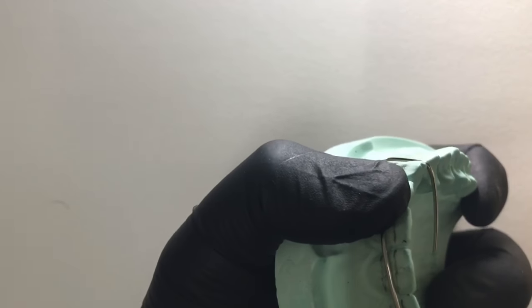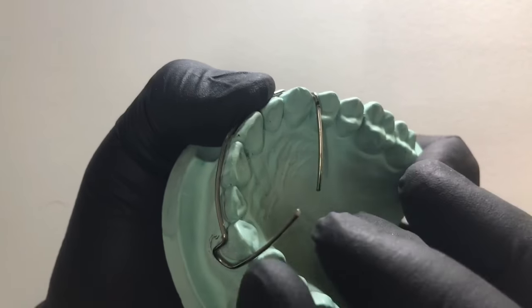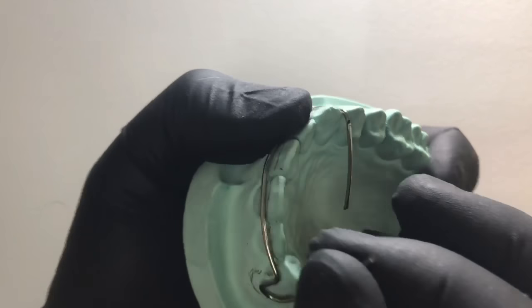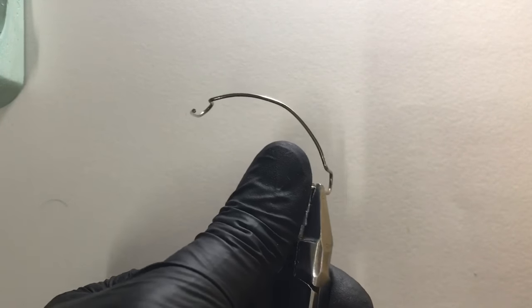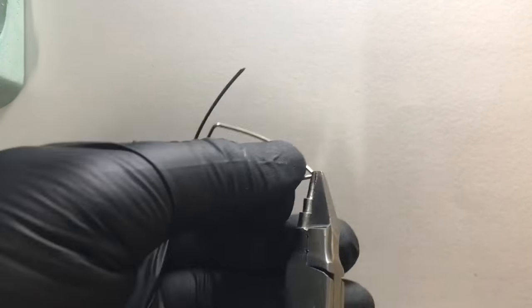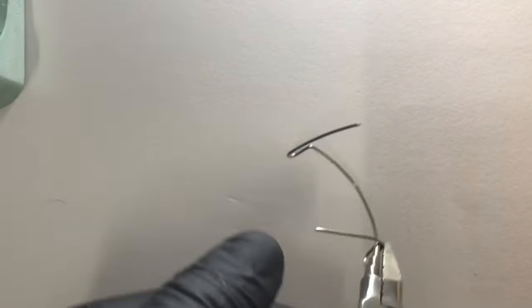Now we need to go completely into the palatal aspect. For that we need to give a slight marking at the free end. Engaging at the rounded beak of the universal plier, we give a complete bend inside, as you can see.